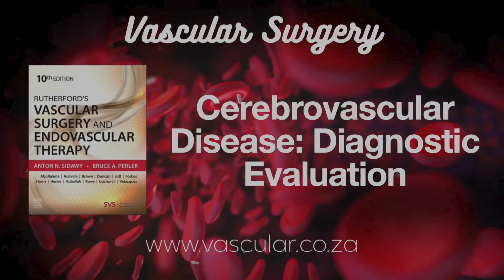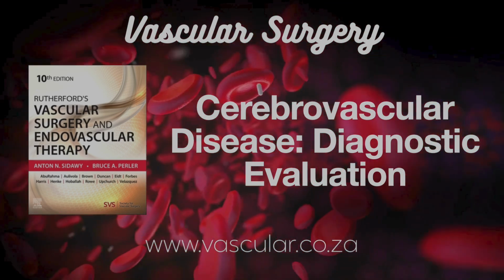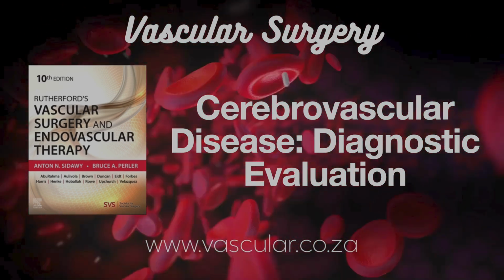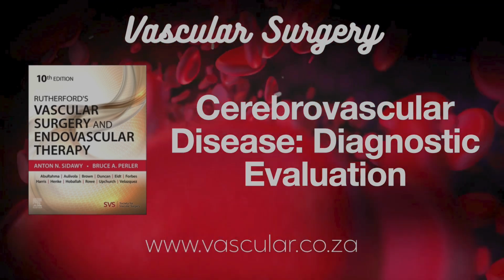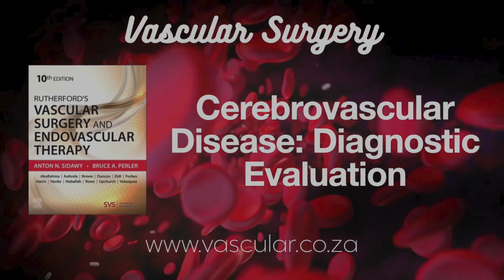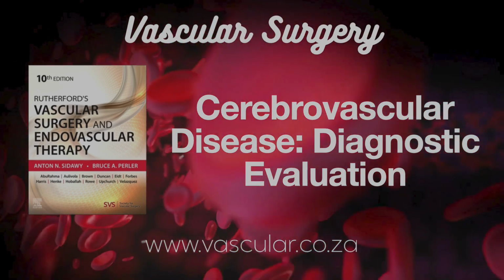So DU alone can be enough in clear-cut cases? In many clear-cut cases, yes. When would you need to go further, get that additional imaging, like CTA or MRA? You'd typically need more imaging if the DU study wasn't technically adequate. Maybe the images were poor quality or it was non-diagnostic for some reason. Okay. Or if it showed that intermediate 50-69% stenosis in an asymptomatic patient, that gray area where DU is less precise. Or anytime you really need to evaluate the vessels either upstream, like in the chest, or downstream towards the brain, beyond what the DU could clearly see. So filling in the gaps or clarifying uncertainty.